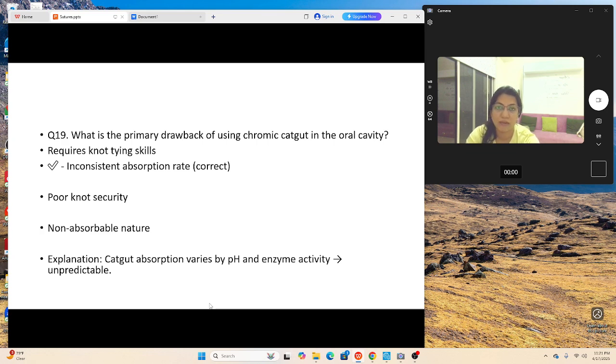See, each suture is having its own characteristics. My suggestion is when you're making your note, write absorbable, non-absorbable. Under absorbable, you can write Vicryl. Get all the information you can on Vicryl, like how it is made, how much time it takes to dissolve, what it is made of, and which areas you will use, which areas you will not use. So for each suture you have the history, geography, and characteristics of it. There will be like 10 different pages comprising all the sutures, but that will help you in the exam, and of course that will help you to become a better clinician as well.